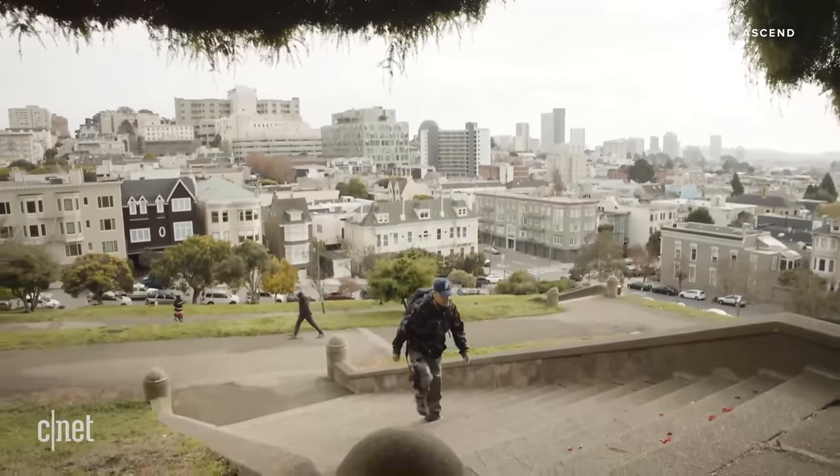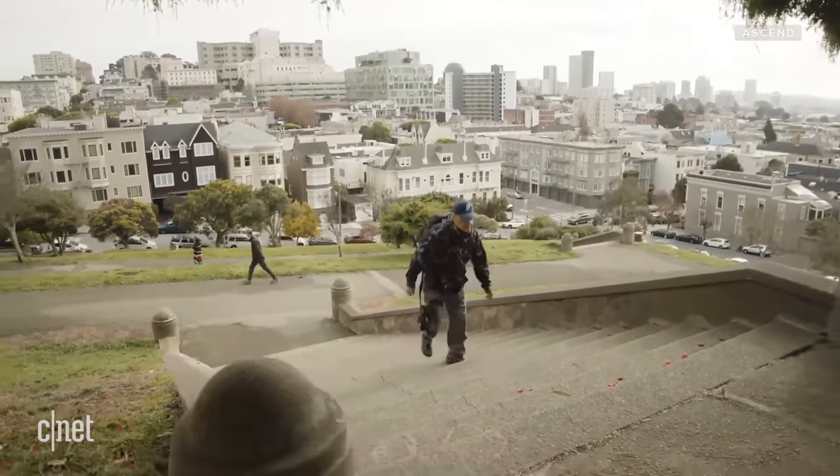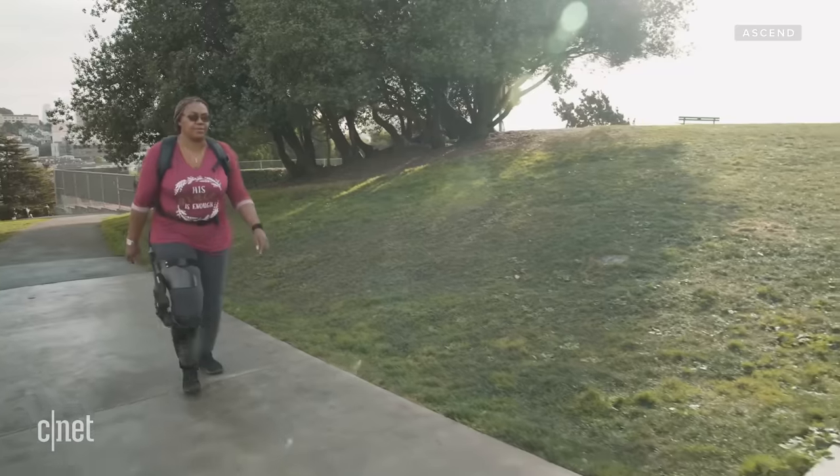For most of our customers, they're looking for support on activities of daily living. So we're targeting things like in and out of chairs, up and down steps, and level ground walking.